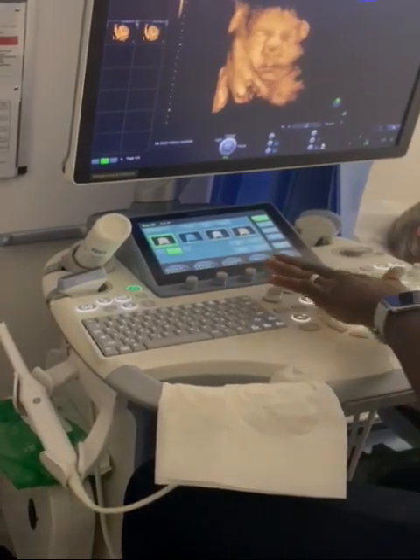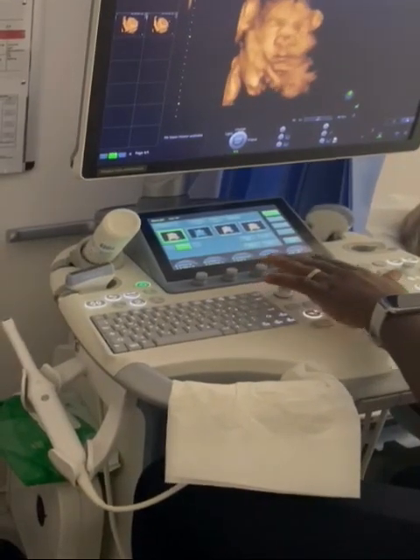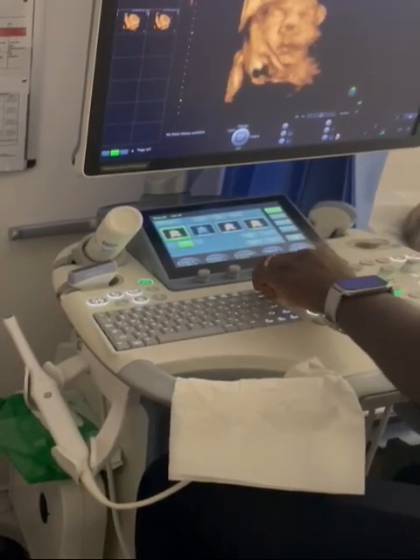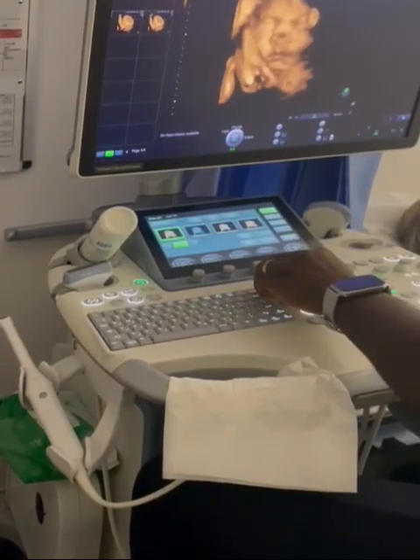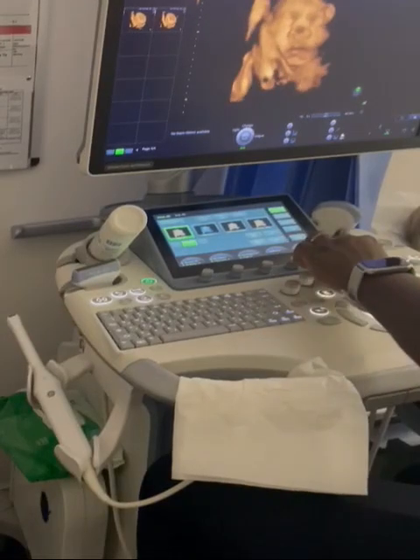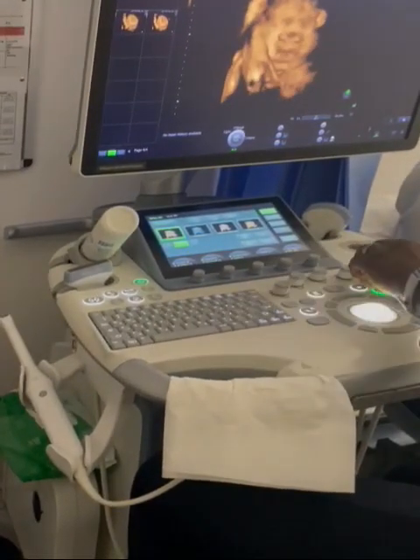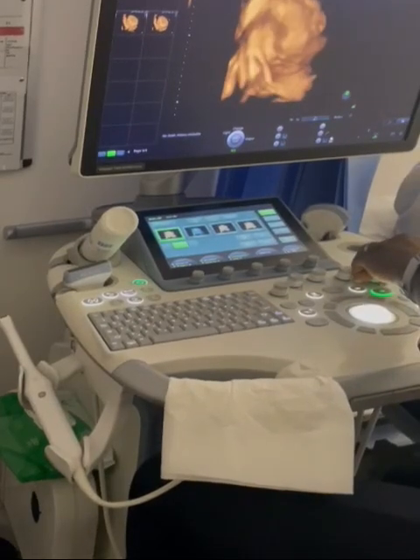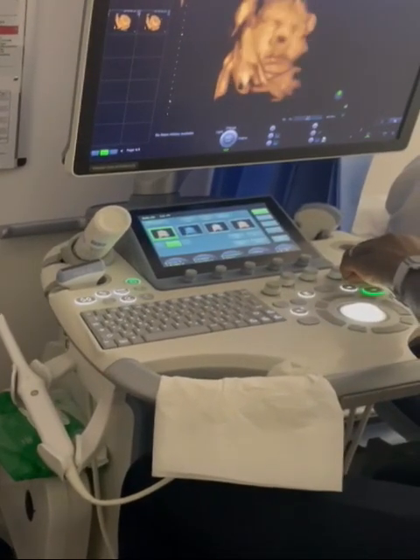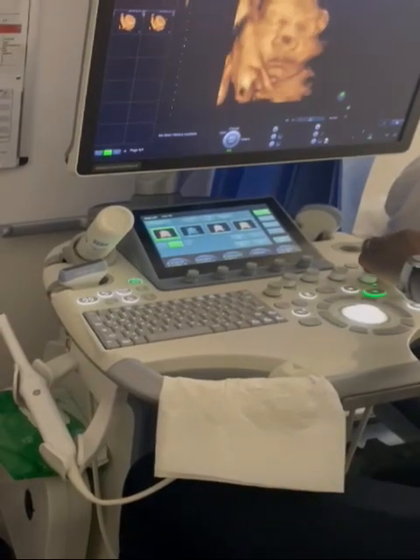So if you look at my keys, can you show them this? So you have the X coordinates, Y coordinates, Z coordinates. If I do this, you can turn the baby around. The Y coordinate turns it in the vertical axis, and the Z coordinate in the diagonal axis. And the 2D key is just to add to the baby or remove part of it to smoothen that image. And I can zoom in, zoom out the baby.